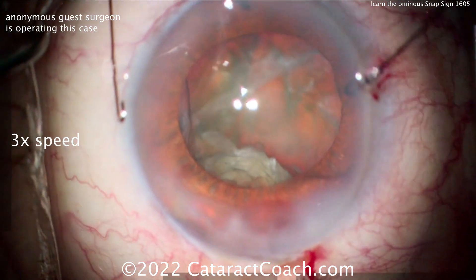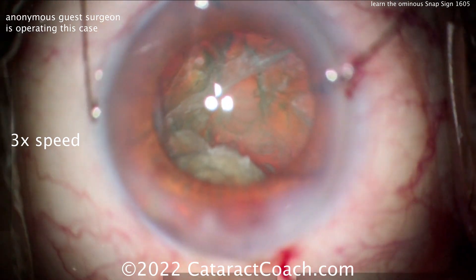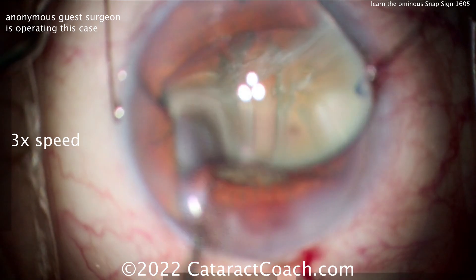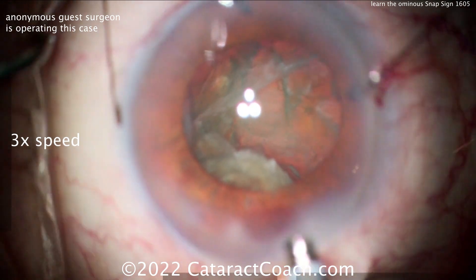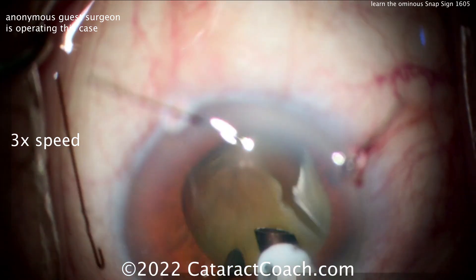This is a tough thing — it can happen to any of us, but you've got to be vigilant. The snap sign was that sudden snapping of the anterior chamber and the pupil, and you notice that when you have an instant blowout of the posterior capsule. Now look at that high infusion — and there it goes. Gone.